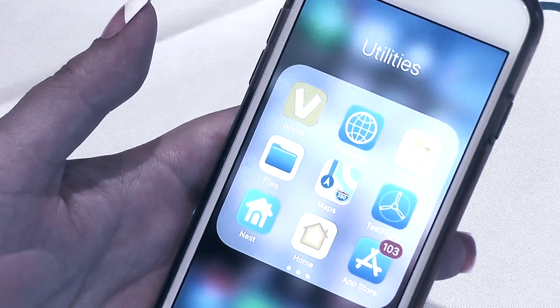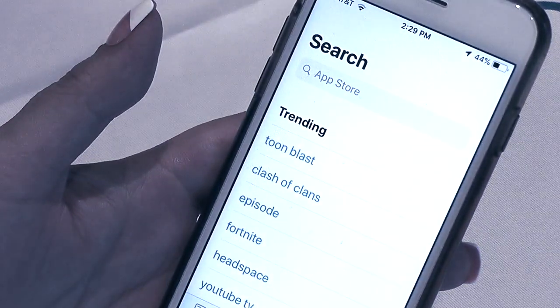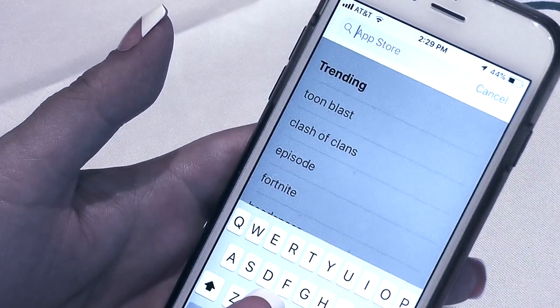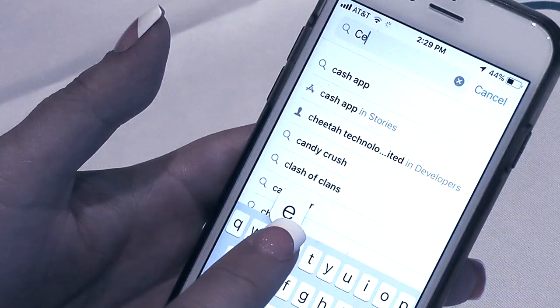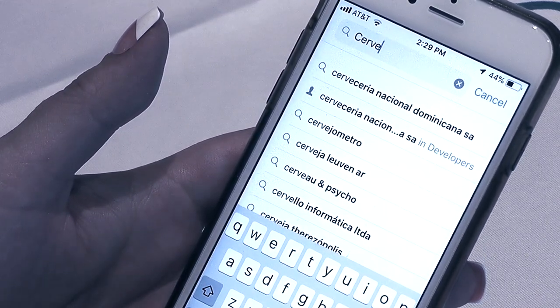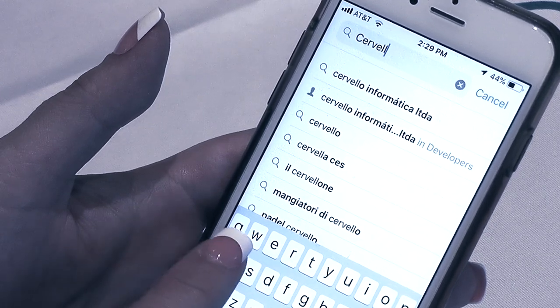While your Cervella device is charging, let's download the free Cervella app from the Apple App Store if you use an Apple device, or from the Google Play Store if you use an Android device. Simply search for Cervella in the search box and you should find the Cervella app for your smart device.